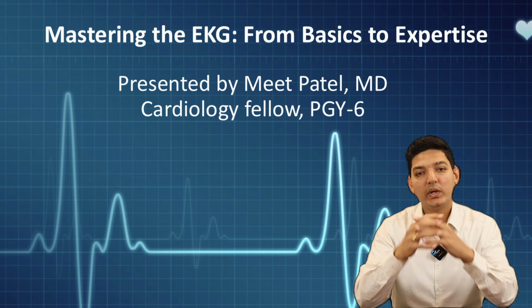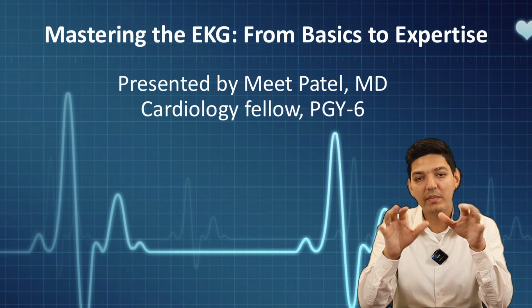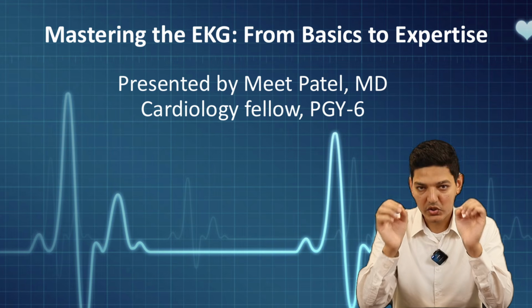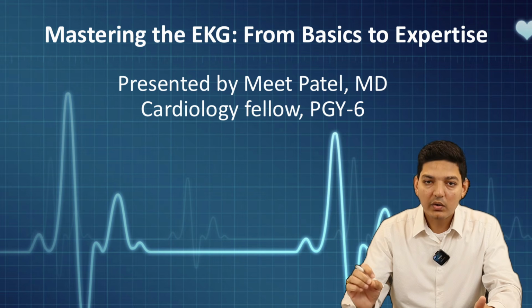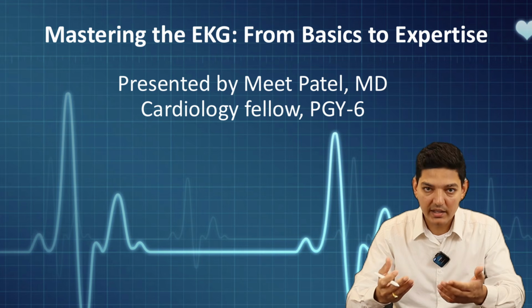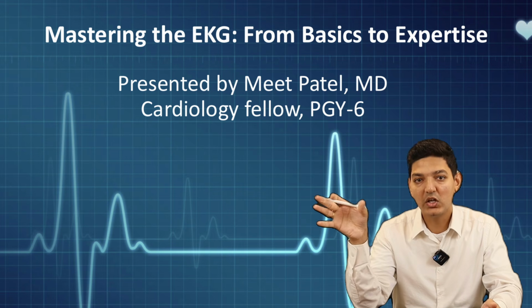Now I've been doing this EKG series with family medicine residents, internal medicine residents and medical students for the last 2 years. And one thing I can assure you and say with full confidence is that after going through all the video lectures, you will not only start reading EKG with more confidence and clarity, but you'll actually start to understand what is going on inside the heart and what is the underlying mechanism that makes EKG look the way it looks.